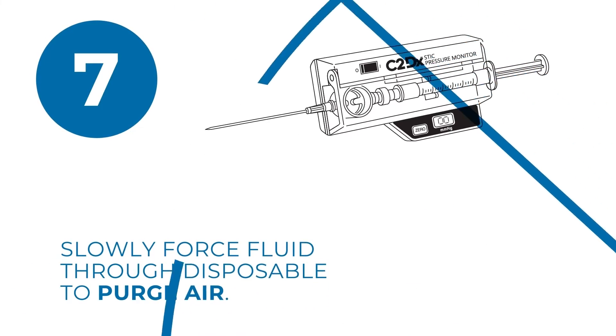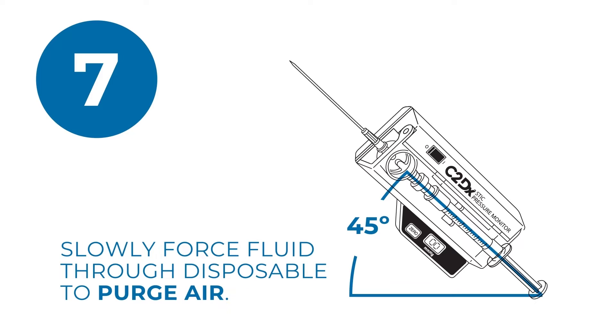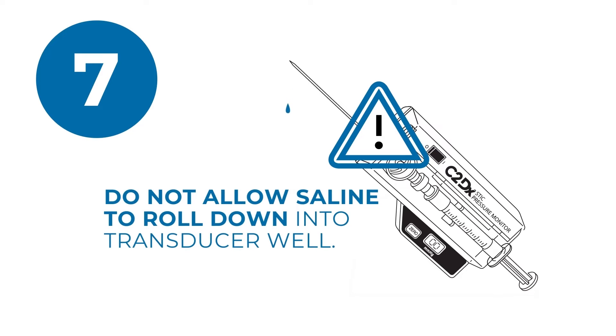Now hold the device approximately 45 degrees up from horizontal. Gently force fluid through the disposable, but do not allow the saline solution to roll back down into the transducer well.